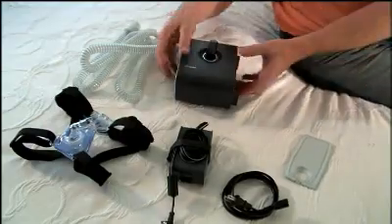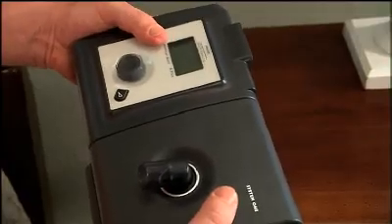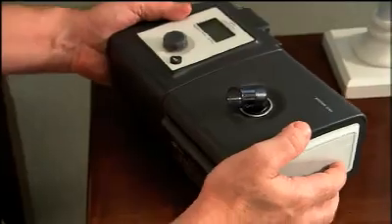Line up the device and humidifier so the guides on the humidifier fit into the slots on the device. The air outlet port should fit into the air inlet port on the humidifier. Press the two together until they snap into place.